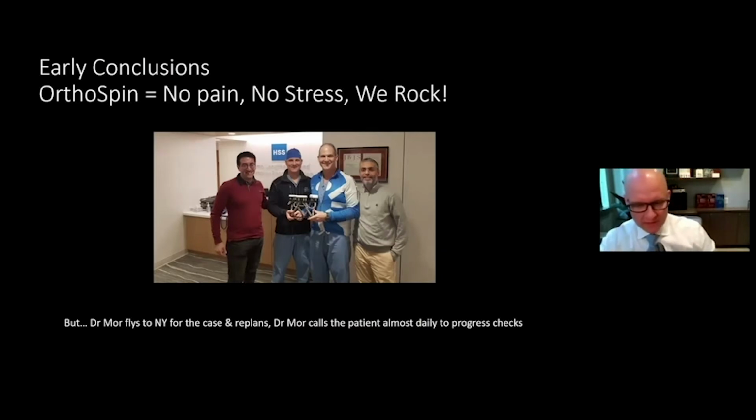So the stress of knowing you have to adjust your strut and that, gee, strut 4 really hurts every time I adjust it, and just knowing all day long you've got to do that adjustment and it's got to be a full millimeter. So there's a stress level that probably feeds into the pain pathway. And then there's also the physical jump of a whole millimeter at a time. Sometimes it's 2 millimeters, and we'll tell the patient, well, do half of strut 4 in the morning and half of strut 4 in the afternoon. It starts getting pretty complicated.